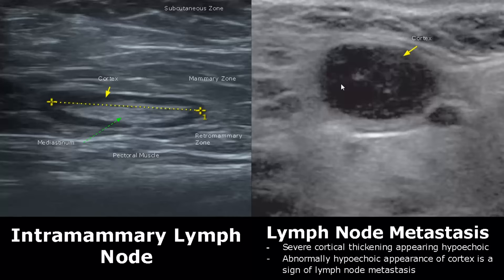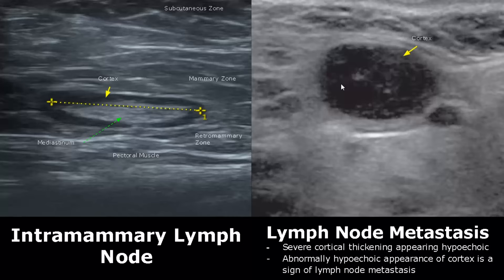Comparing it with a non-malignant lymph node, the cortex is very thick, giving it an abnormally hypoechoic appearance. This is usually a sign of malignancy.